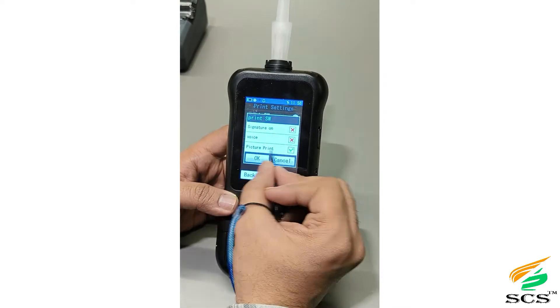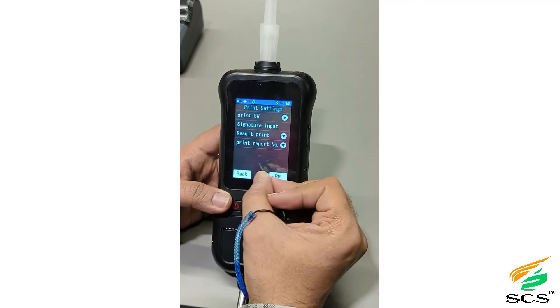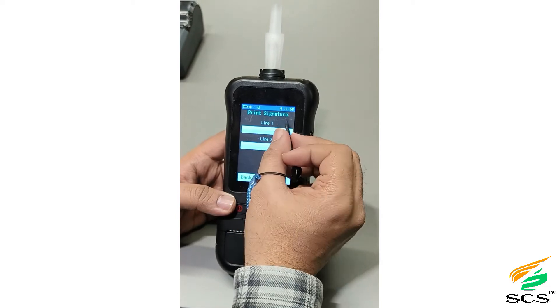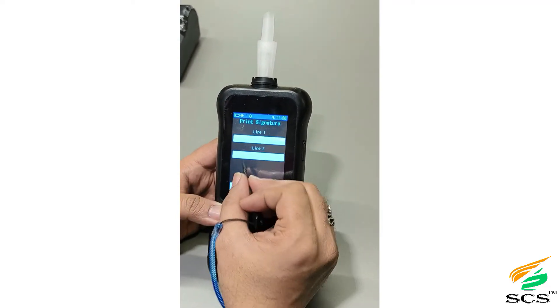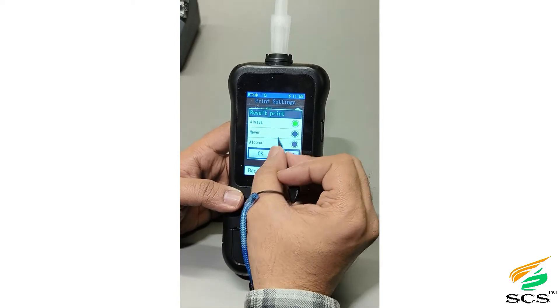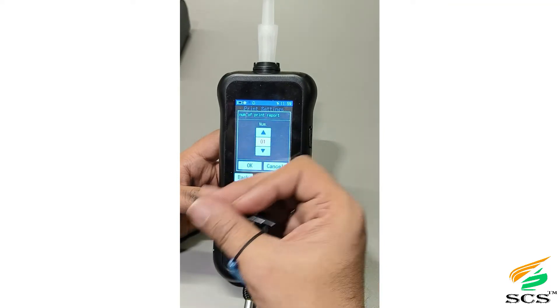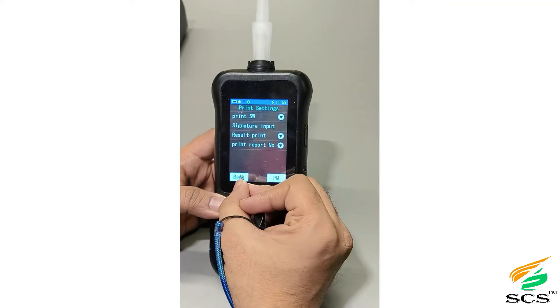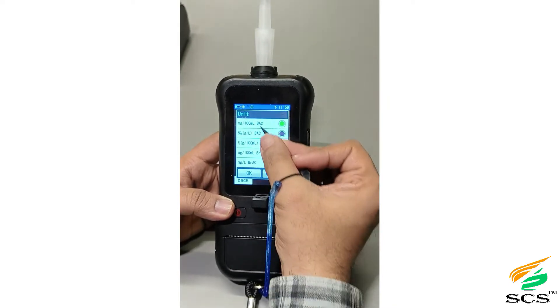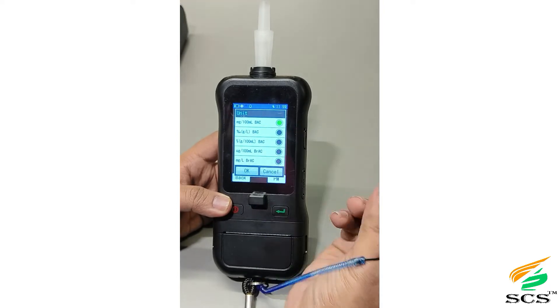If you want to print a picture in the printout, enable the picture print option. You can write the name of any officer in the printed signature field. The result print option will always remain on by default. In the print report settings, you can set the number of copies to be printed. In other settings, unit selection allows the user to select whichever unit they require according to their needs.